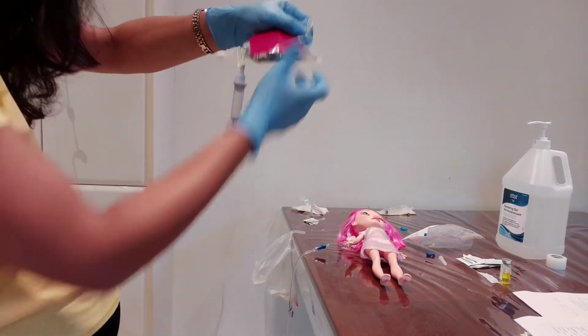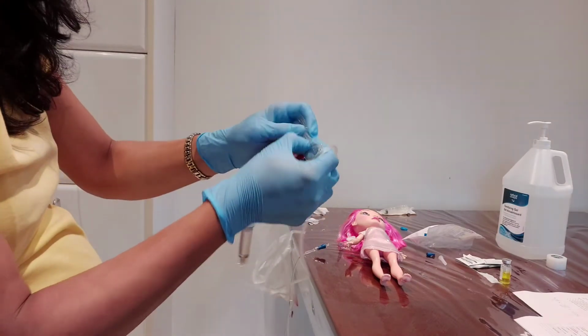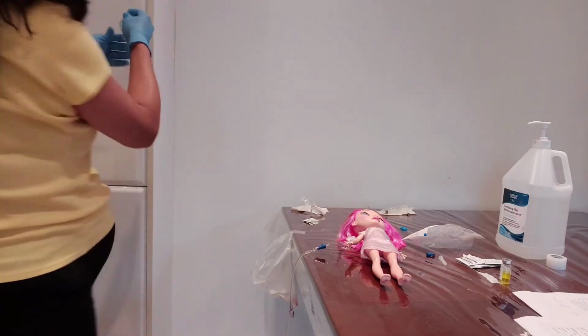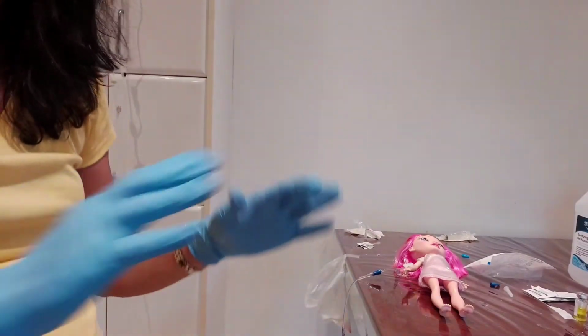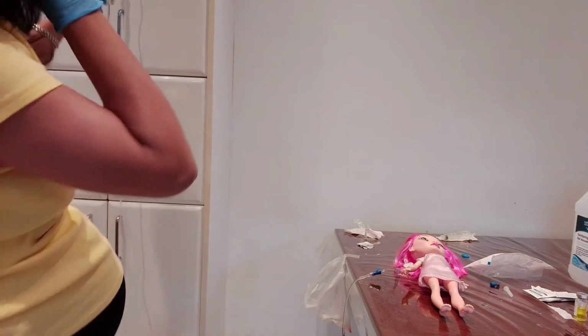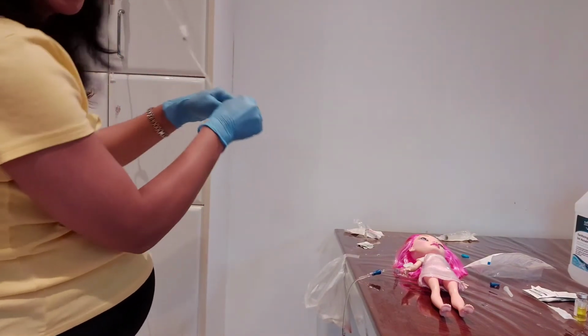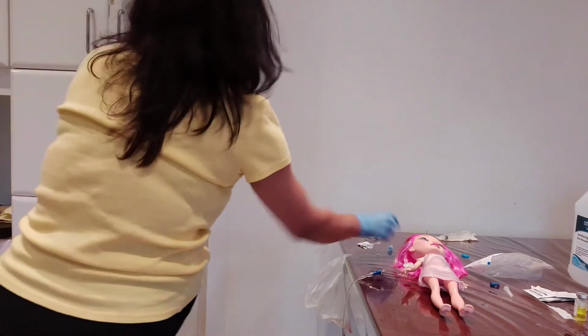I will hang it higher than the primary bag. I know that I don't have to touch anything, but I need to show you. I will recap this one.